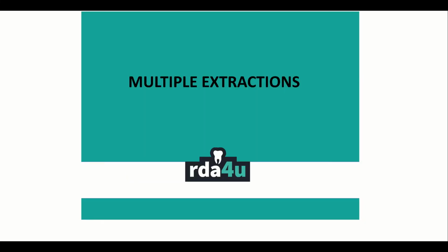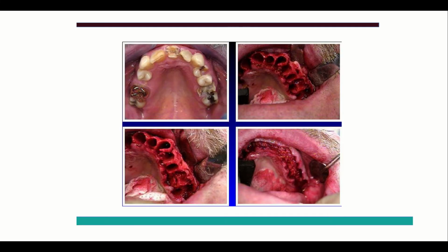All right, a few pictures again, a little bloody, guts and gore, on multiple extractions. Okay, so you can see in this case we have some severely decayed teeth. There's probably a lot of bone loss. This one looks pretty bad as well. Looks like there's a bunch of plaque at the gum line there at number 6. So we're going to take them out, and again, could be very loose and easy to get out.